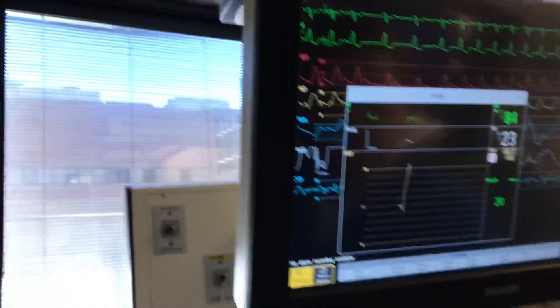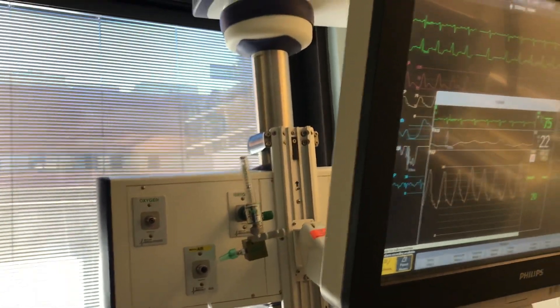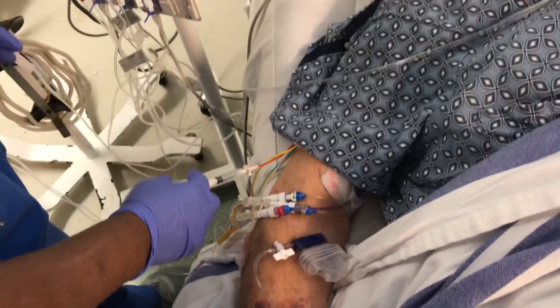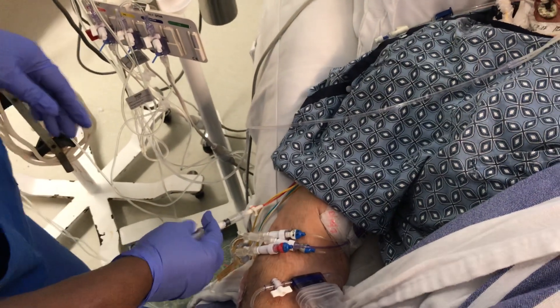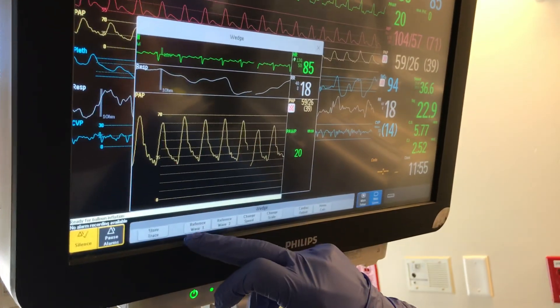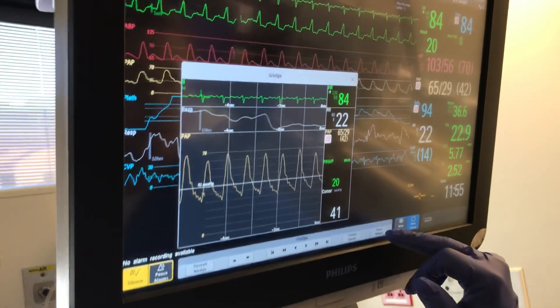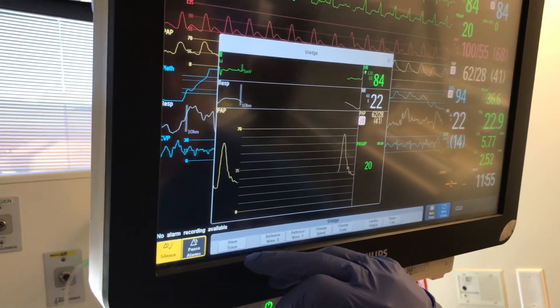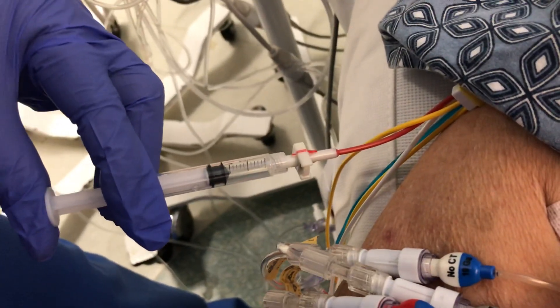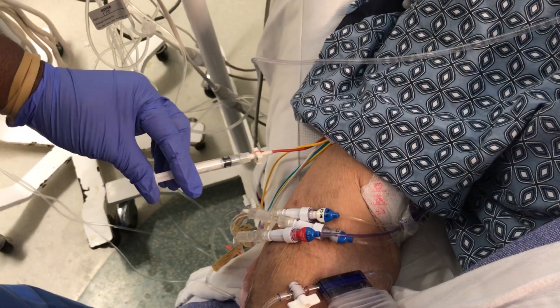And then I'm going to watch my waveform. Can we clear that out? Let me see if I can have them lay down a little further if you can. Let me know how low you can go, sir. This is only if you go so low. So I'm going to start recording here. You go in on an expiration. You wedge. And I'm looking to see — until I see my wave on it — you inflate it up until you see your waveform.